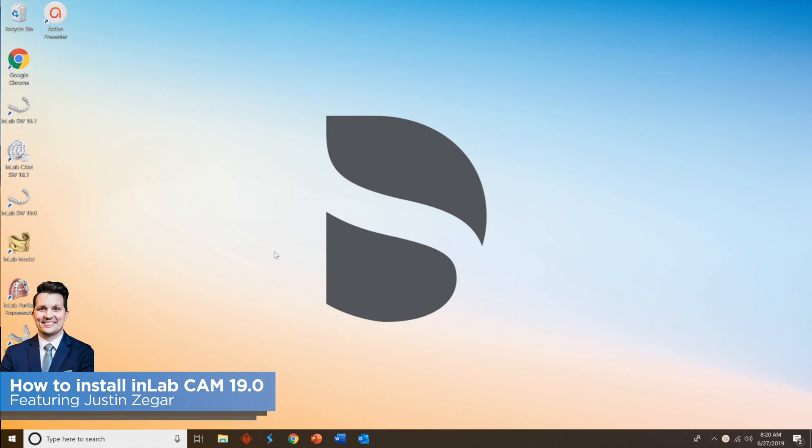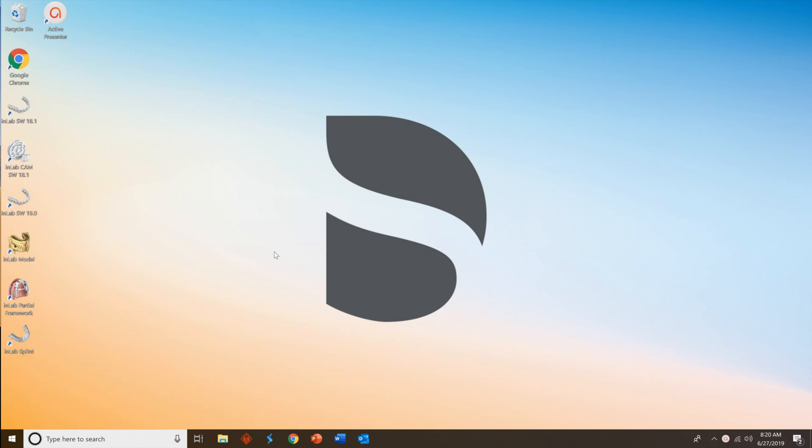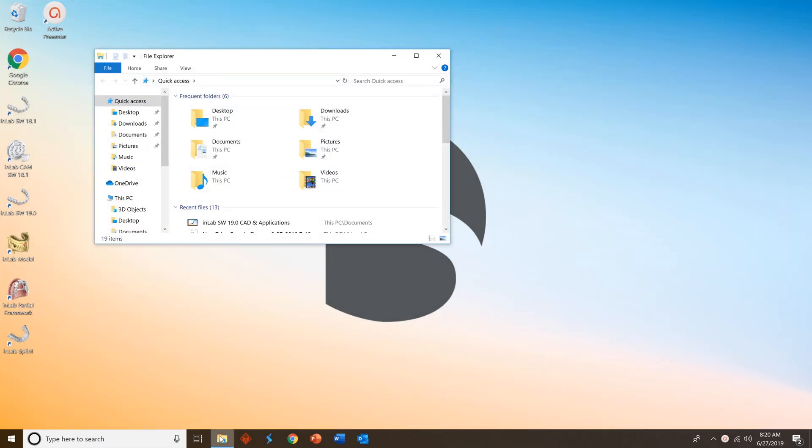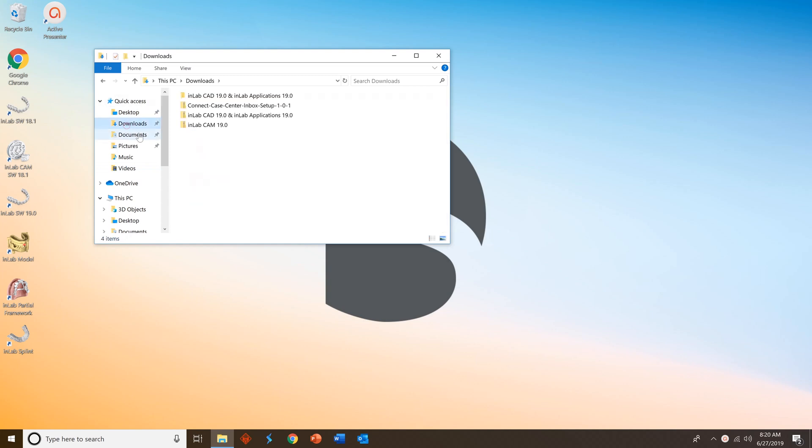Welcome to this quick tutorial on how to install our new InLab CAM software 19.0. The first step is to navigate to your download folder. Look for the InLab CAM 19.0 zip file.